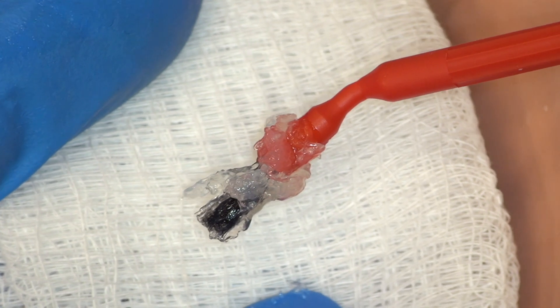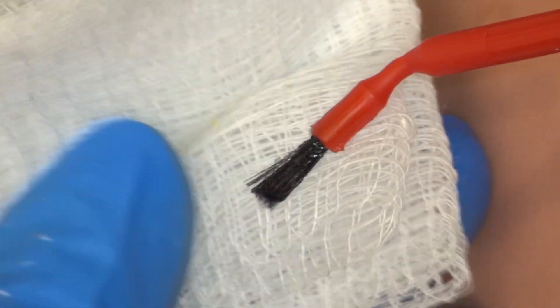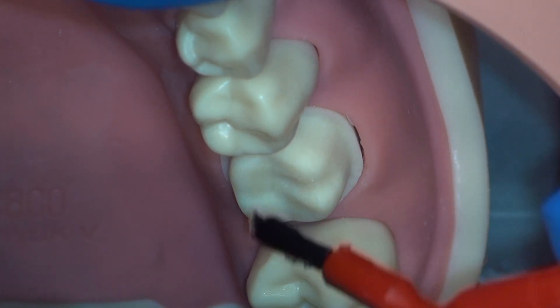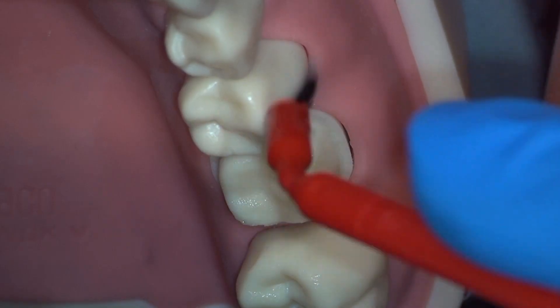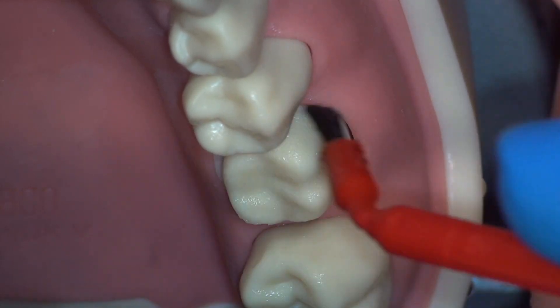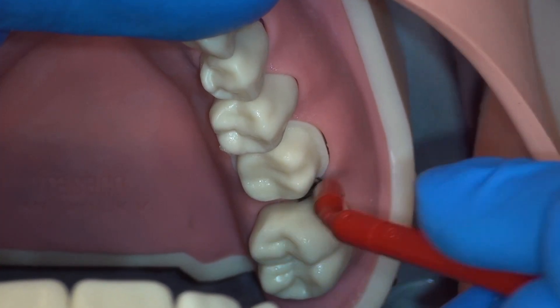Next, we will apply Vaseline as a separator to our preparation. This is too much Vaseline — wipe off the excess and apply a thin layer to your crown preparation. The thinner the layer, the more intimate the fit of the temporary will be. If you apply a thick layer of Vaseline, that can cause a bumpy internal surface, a poor fit, and even an open margin.